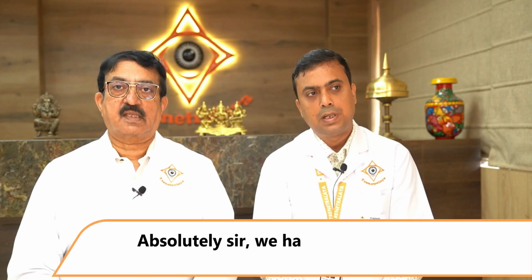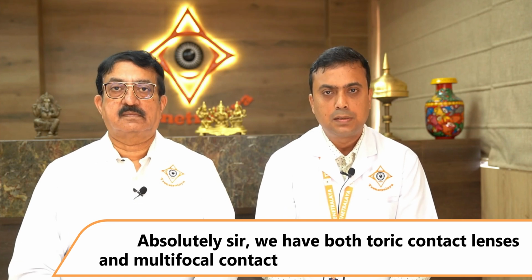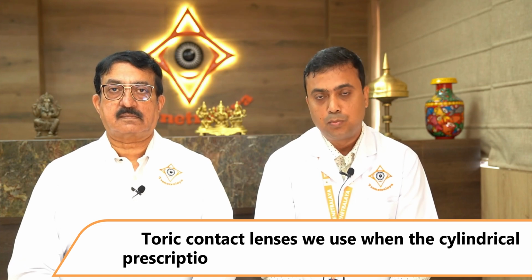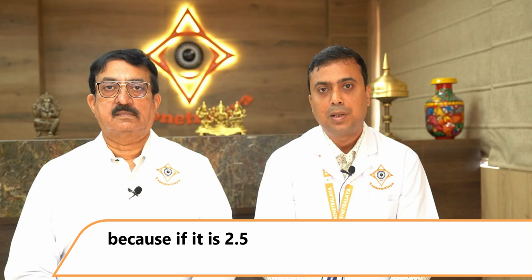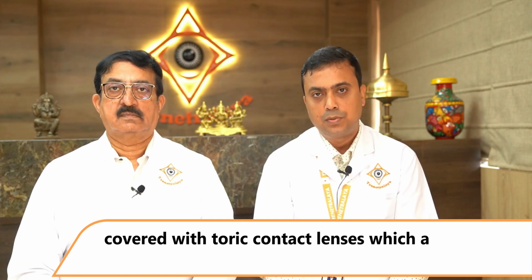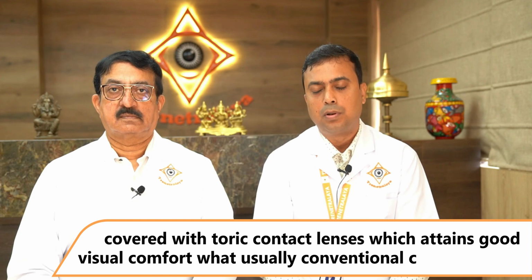Absolutely, sir. Actually, we have both toric contact lenses as well as multifocal contact lenses in our armamentarium. Toric contact lenses we use when the cylindrical prescription is more than one diopter, and below 2.5, because if it is 2.5 and above, then we usually prefer RGP contact lenses. But more than one diopter of astigmatism can be covered with toric contact lenses, which attains good visual comfort, what usually conventional contact lenses cannot cover.